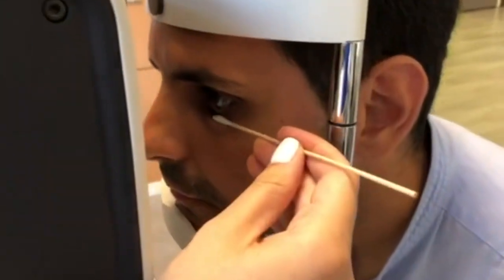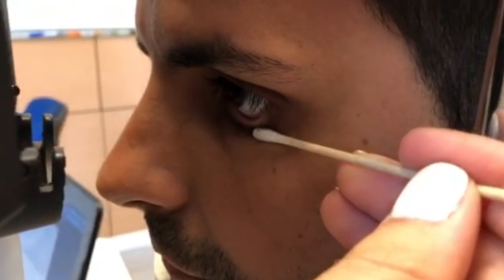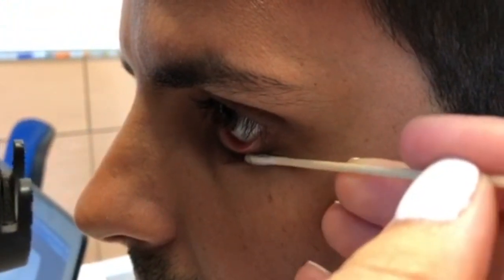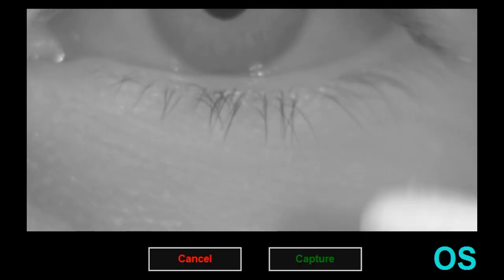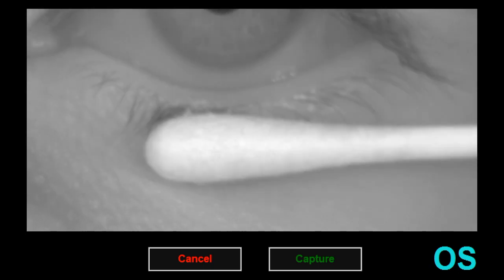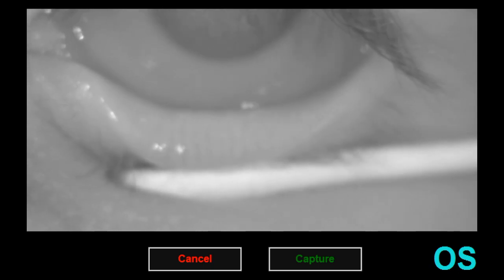With a Q-tip or cotton swab, invert the patient's bottom eyelid to expose the gland. Place the cotton swab on the bottom lash line and gently pull downwards.